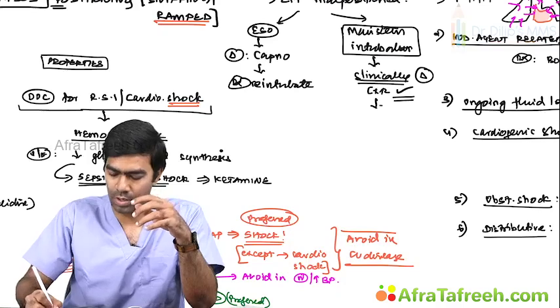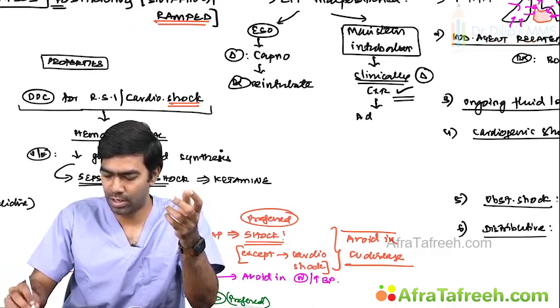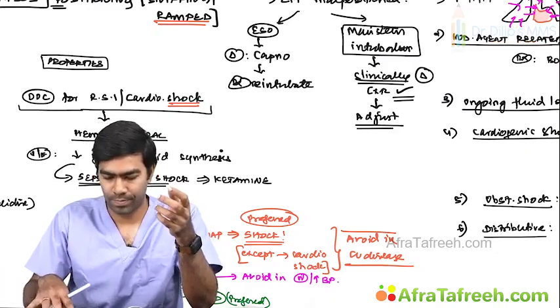So clinically, first you have to assess the patient. Whenever you have intubated the right bronchus, it means it's a mainstem intubation, an endobronchial intubation. Only the right side chest will start expanding and you'll have an asymmetric chest rise. Left side is not going to expand. And you are only going to hear breath sounds on the right side. On the left side, you're not going to have any breath sounds at all, especially when you're auscultating in the axilla. So this asymmetry will tell you you're probably having a right endobronchial intubation. In this condition, no need to take the tube out completely. Just pull the tube out a little bit and the patient will be all right. Adjust the tube. Okay.